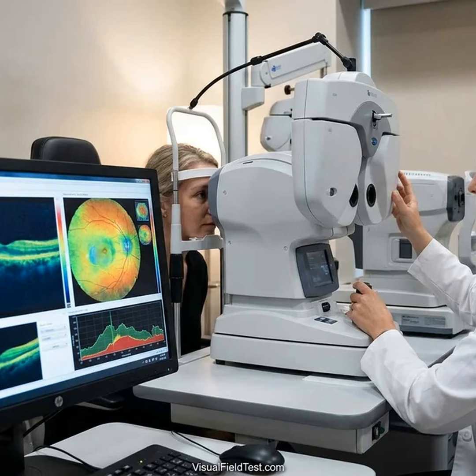How does this fit with my other tests? Always see OCT in context. You can say, my vision test was stable, but this OCT is worse. What do we trust? Or vice versa. This prompts the doctor to discuss the full picture.